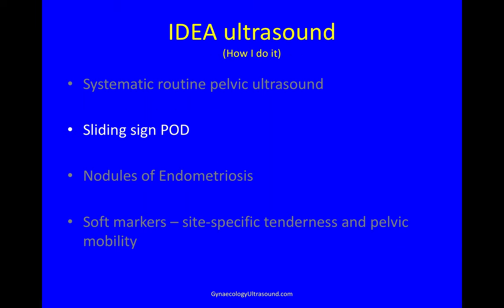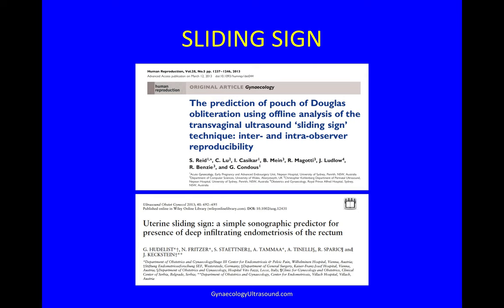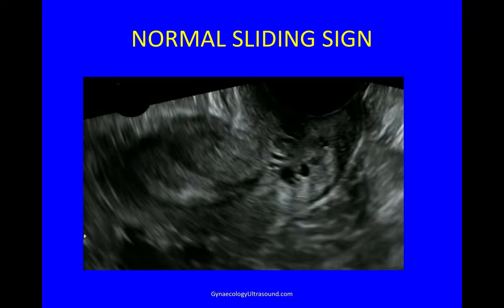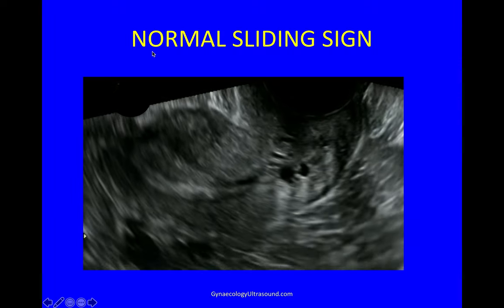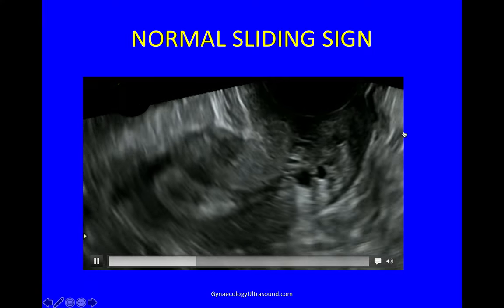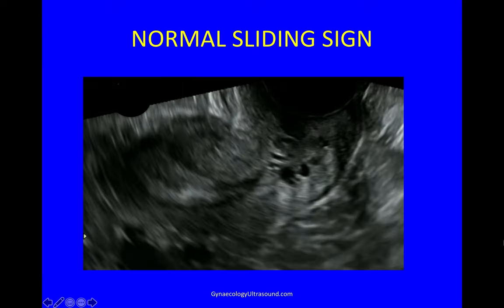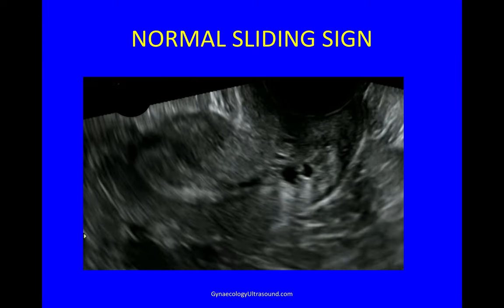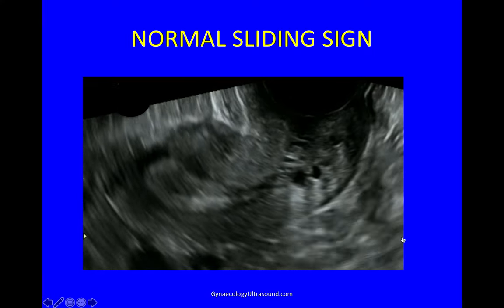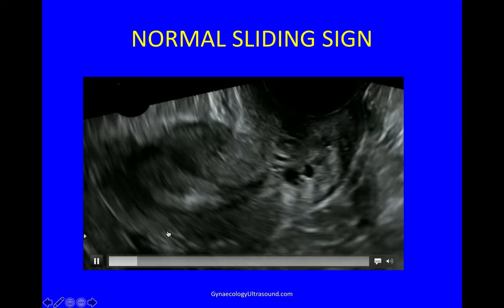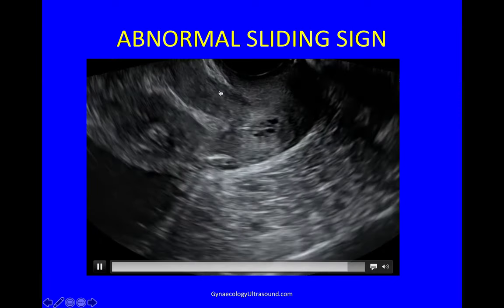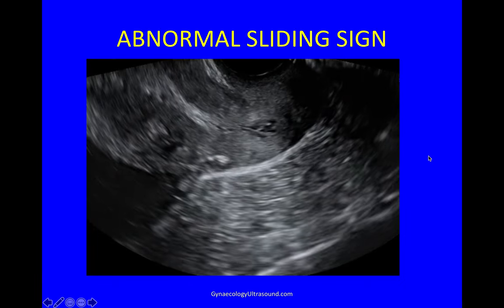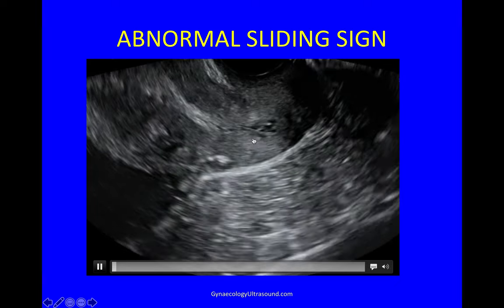Having done a normal systematic routine pelvic ultrasound specifically looking for those features, next I'll do the sliding sign. The sliding sign was published in 2013 and is something we should absolutely do in every single pelvic scan. In a normal sliding sign, on very gentle movement of the probe the bowel moves one way and the cervix moves the other — there's entirely free mobility behind the uterus. Comparing that to an abnormal case, you can see things move but it all moves together because everything is adherent to the back of the cervix.